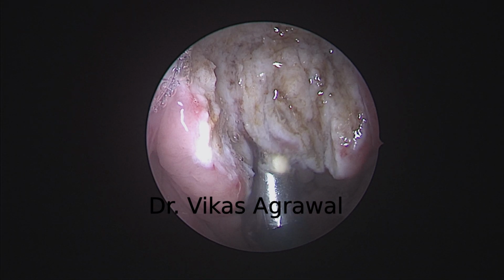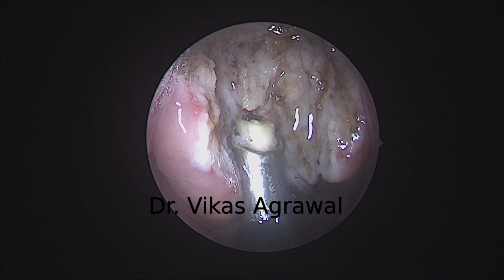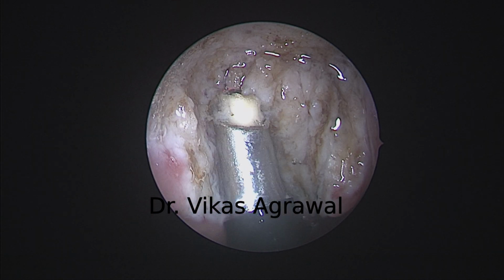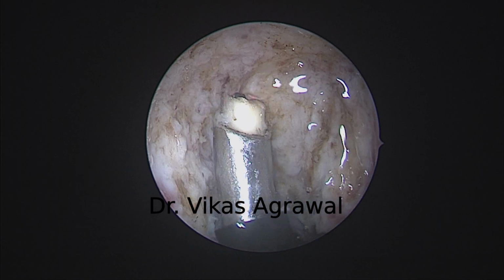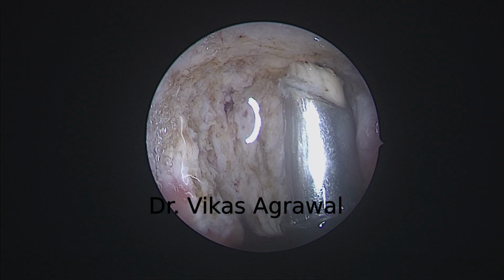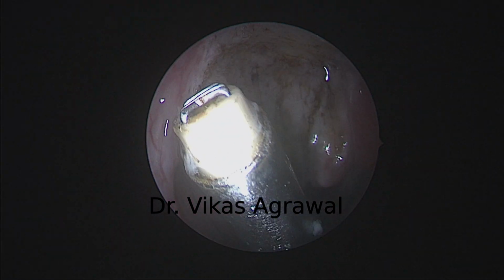So the most logical solution is to deal with the root cause of the problem rather than dealing with the effect. So now that's the superior boundary of the adenoids completely defined, which is the buccopharyngeal fascia.